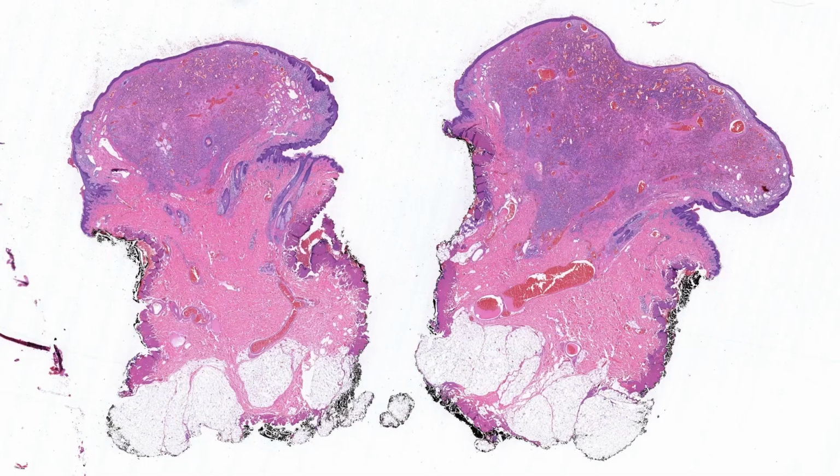Case 3 is a pedunculated mass arising on the upper back of a 15-year-old male. At first glance, I see that this lesion has an exophytic, almost dumbbell-like growth pattern. It is well circumscribed and unencapsulated and extends into the mid-dermis. There's a large vessel in the deeper dermis, which I could presume is associated with the lesion.